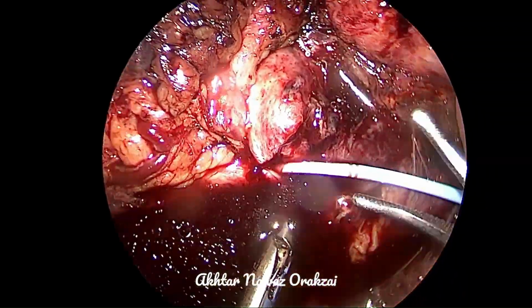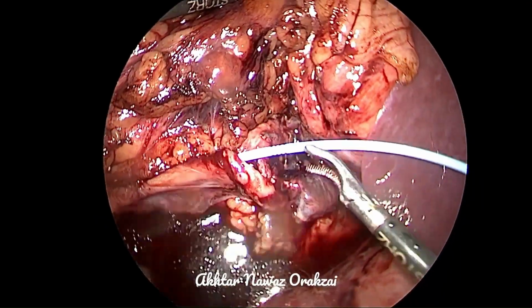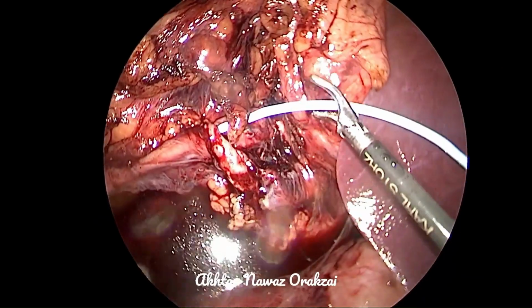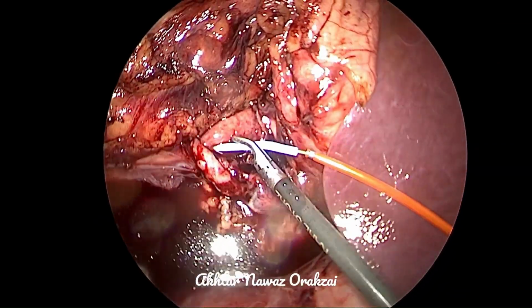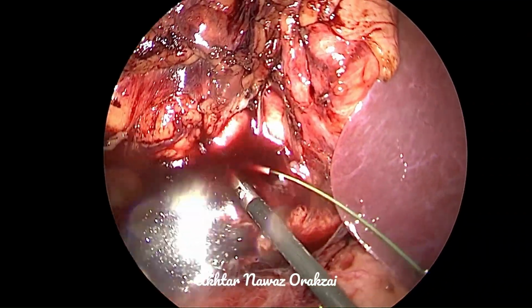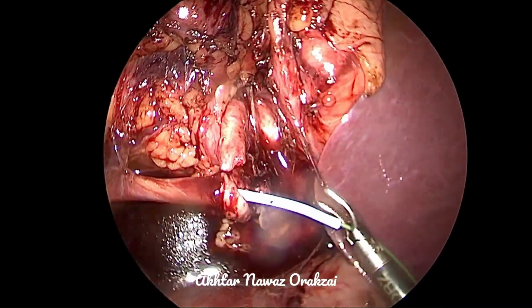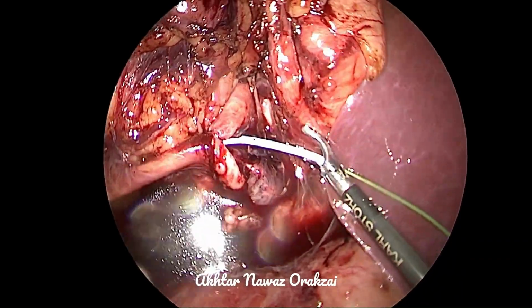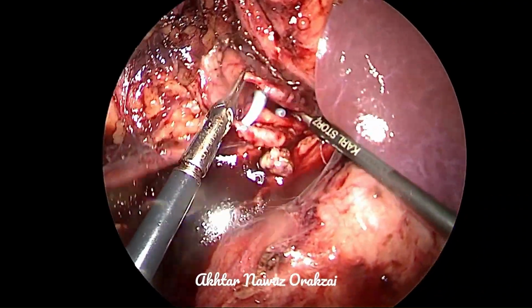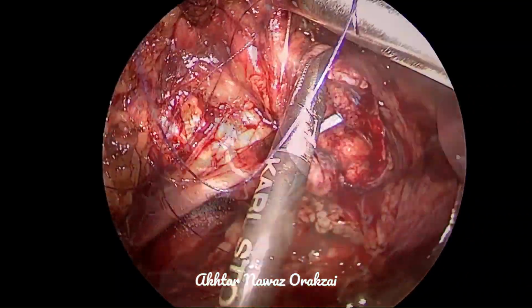I use a 2 millimeter port for placing the DJ stent, and in this case I placed that 2 millimeter port in the already placed 5 millimeter port for liver retraction, so I did not have to create any other hole. And I place the stent and push it completely into the bladder, and then when the guide wire is removed, it is easy to push it into the pelvis and then pull from the bladder side.